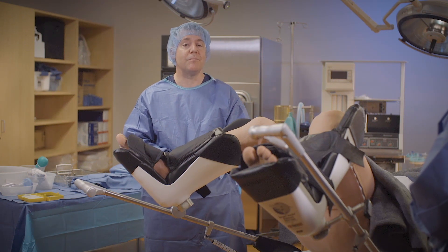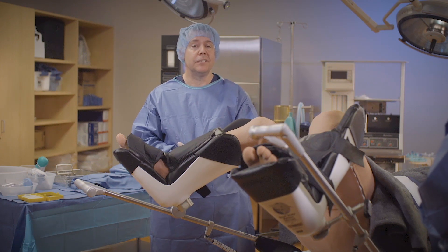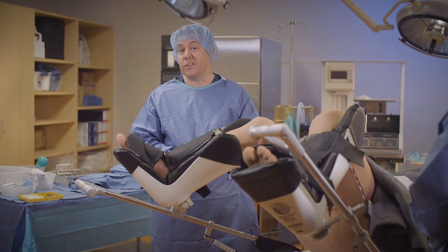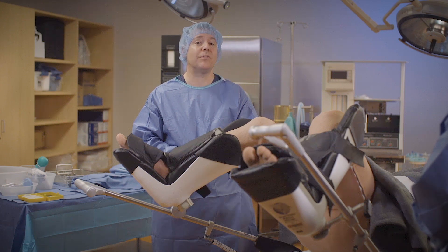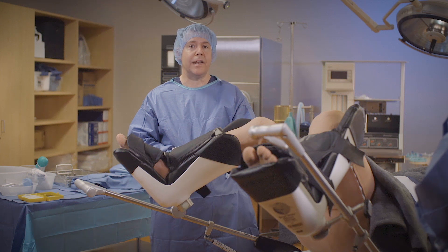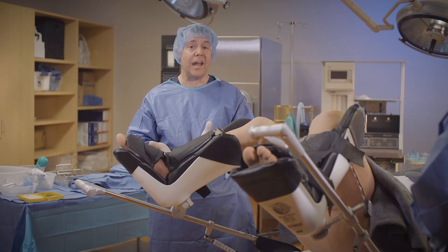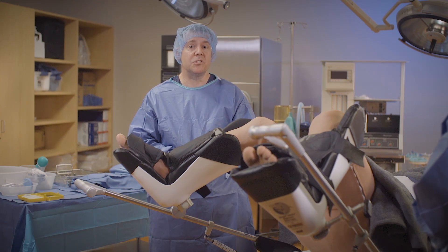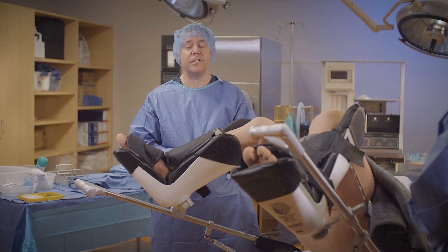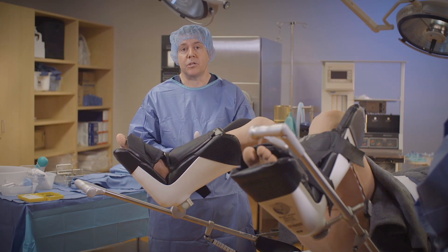So what's first? I've seen two methods. The first method, and the one described in the textbook that I'm going to demonstrate, is to place the under buttock drape first. The second method, and the one I actually like, is placing the leggings first. I've seen many techs use the under buttock drape first and most of them contaminate themselves on the stirrups. Years ago with candy cane stirrups the leg was more vertical and out of the way, but now with adjustable stirrups it's far easier to contaminate your gown. So I think leggings should go first, but I'm going to put the under buttock drape first.